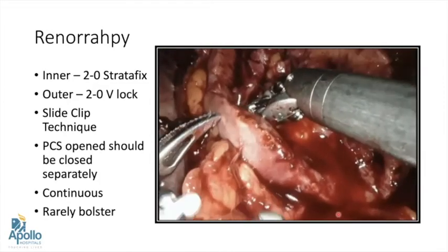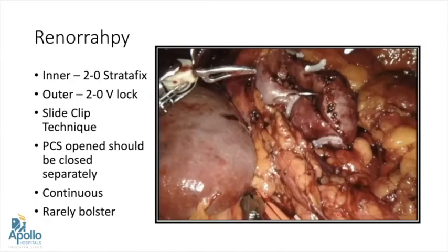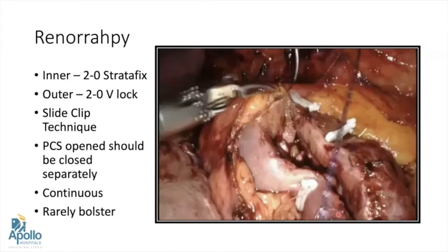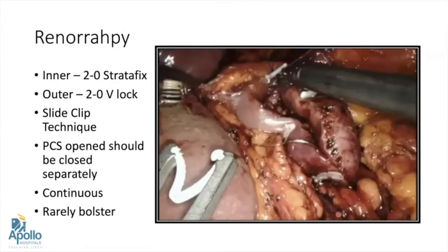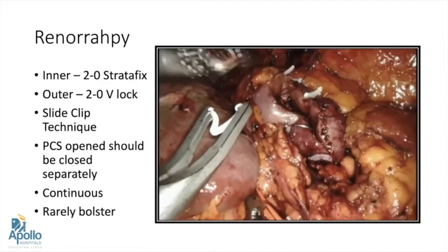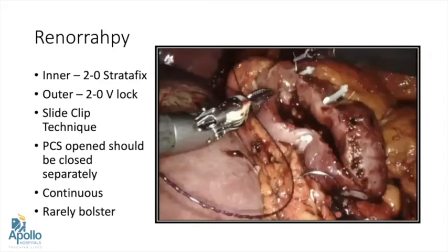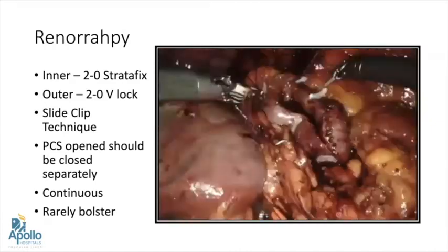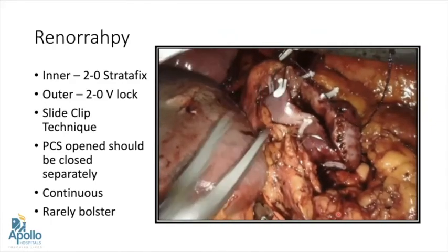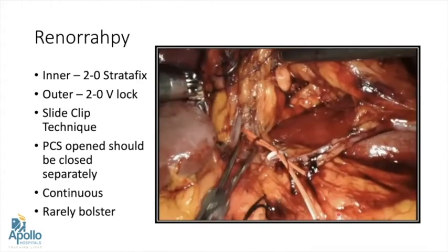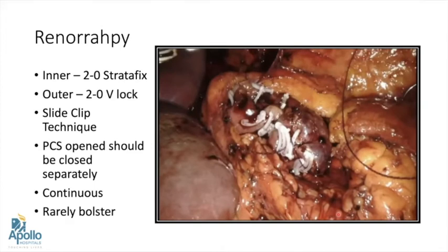For the inner renorrhaphy, I start with a continuous suture where the medulla is sutured. If the PCS system is open, it is sutured individually. Sutures are tied using the sliding clip technique in a continuous manner. The outer layer renorrhaphy is done with 2-0 V-lock suture in continuous method. Once done, the clamp is removed and the kidney observed for at least five minutes, decreasing intraperitoneal pressure to check for bleeding — this is very important to reduce chances of postoperative hemorrhage.